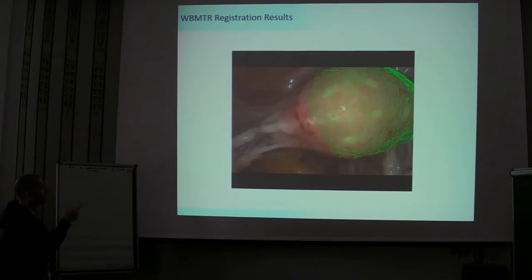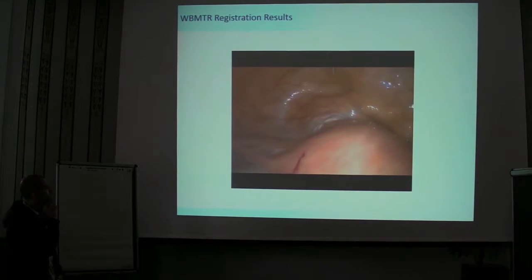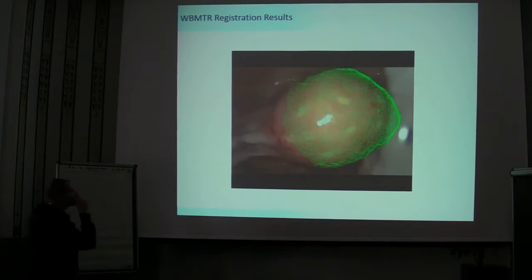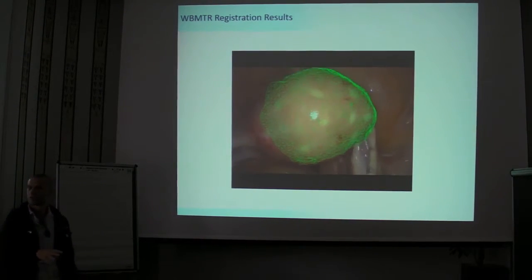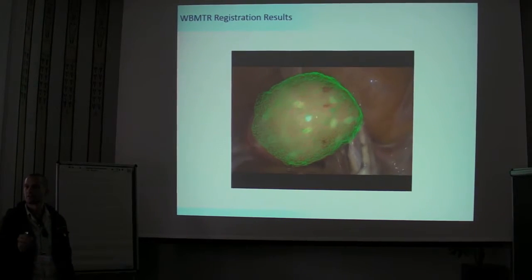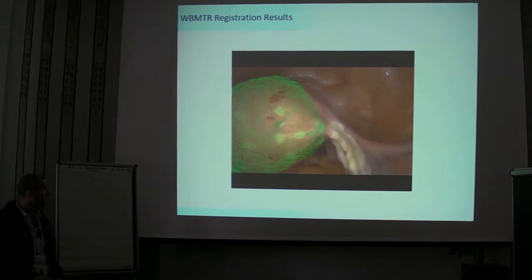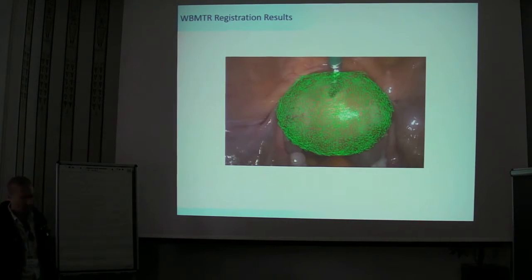So this is an example of tracking that works at 30 Hz on the GPU, and we're quite happy. This is tracking by detection, so it just works independently for every frame. You can see these white marks on the surface. We don't use them; they were there for validation. They are actually burn marks that we asked the surgeon to make, so we can validate quantitatively the quality of the tracking. This is surprising. I was surprised that they accepted that. Well, that was prior to hysterectomy, which means they were going to remove the uterus.